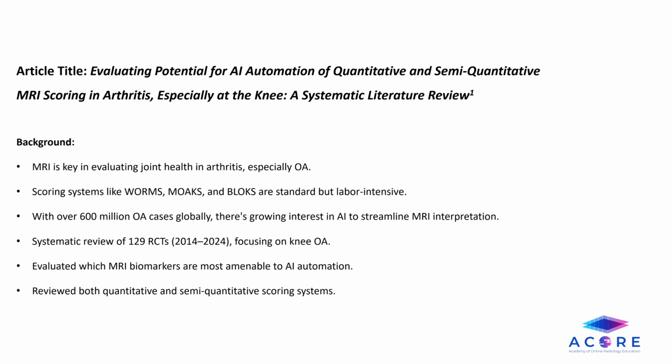Researchers evaluated which biomarkers on MRI, such as cartilage loss, effusions, synovitis, bone marrow edema, erosions, osteophytes, and meniscal or labral injuries, are most amenable to automation. The analysis was guided by expert radiologists and AI specialists who assessed technical complexity, reproducibility, and suitability for machine learning modules.